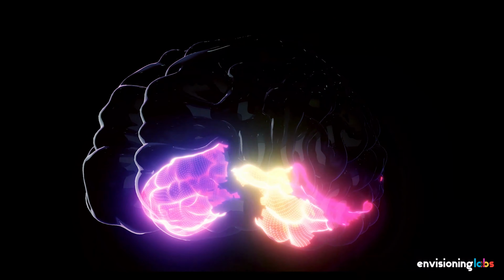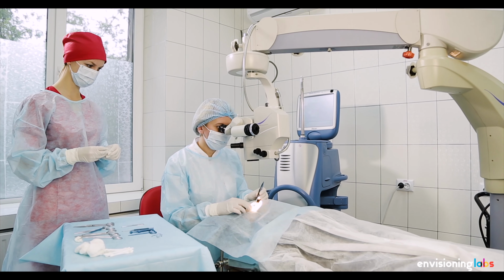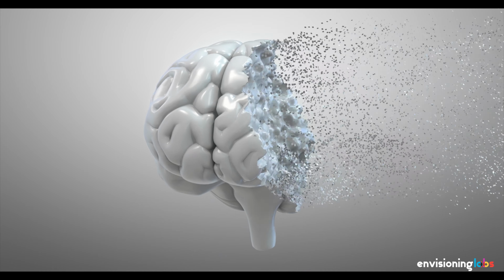The differences between the tumor tissue and the regular brain tissue show up on the overlay in different colors. This allows the neurosurgeons to clearly see the tumor tissue in real time and ensure that they are cutting out the tumor safely.